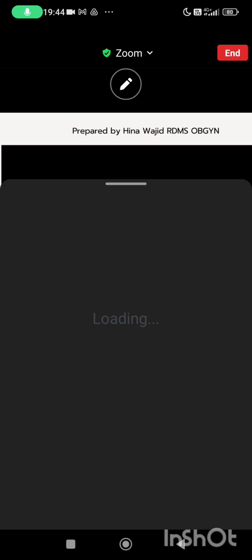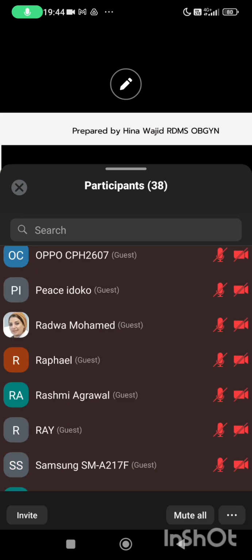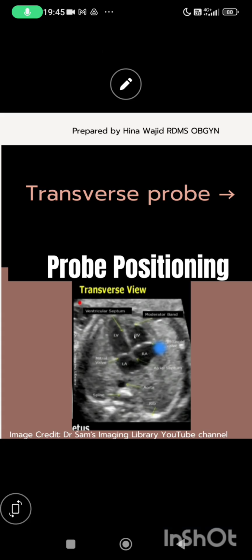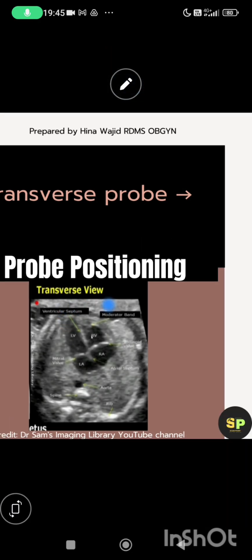Okay, what about this presentation? Clockwise. Yeah, cephalic. Clockwise. Cephalic. Okay. The probe is transverse, so it's a longitudinal line, either cephalic or breech. And now when we compare it from the spine, the relationship here is clockwise. So it means it is a cephalic fetus.